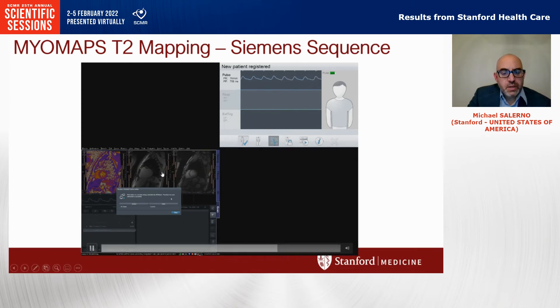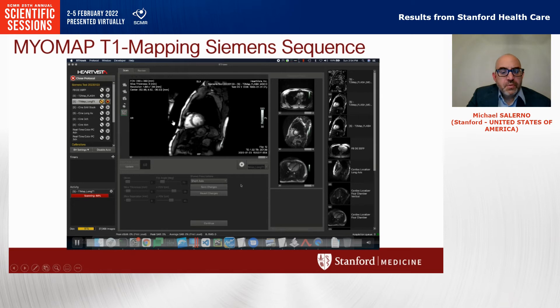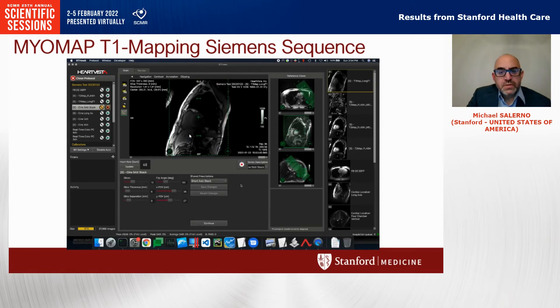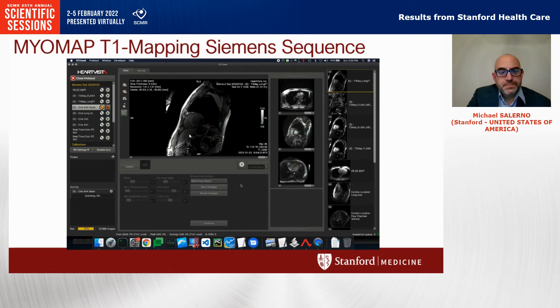Now it's planning the T1 mapping sequences. Looking at this from the HeartVista framework, it's acquiring the T1 map here. The T1 map is going to show up both in the HeartVista framework as well as on the Siemens scanner.